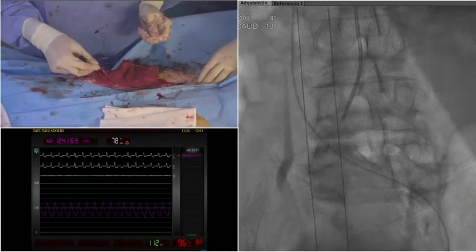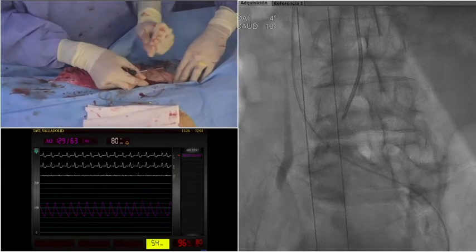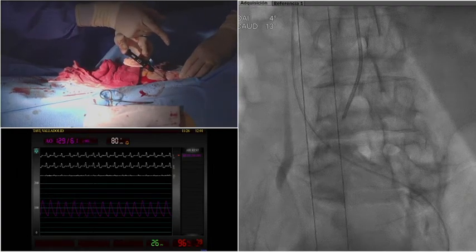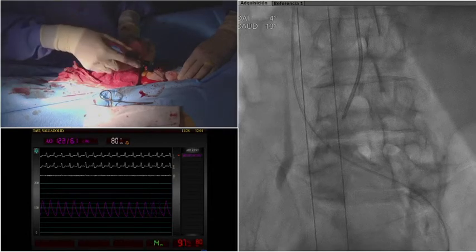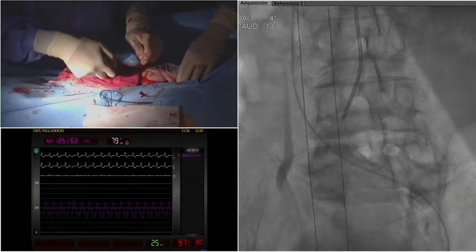So I'm going to remove the wire because it does not seem that we will need an Angio-Seal or something like that. So I push it down. It's very important, this coordination of the first and second operators, that when I go down, he's not compressing even if there is bleeding, because if not, we cannot go to the vessel's wall. Yes, it's a good trick.